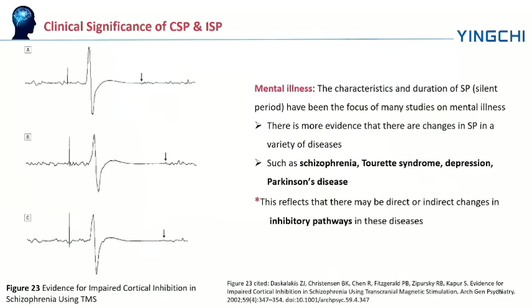So what is the clinical significance of the silent period? The characteristic and duration of silent period have been the focus of many studies on mental illness. And there is more evidence that shows that there are changes in silent period in a variety of diseases.